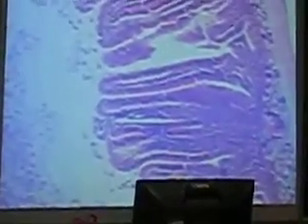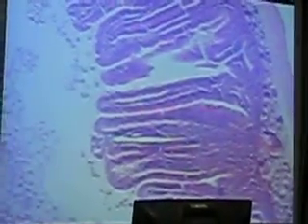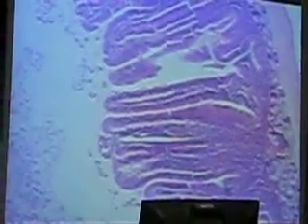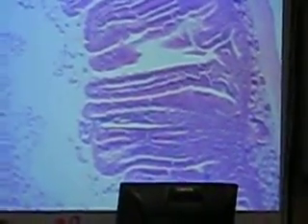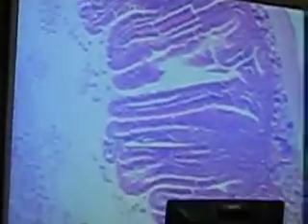One thing you'll notice is when you get into the intestine, you're going to notice these big, long, finger-like structures. Okay, and so here's a nice extended finger-like structure called a villus. Each villus contains epithelial tissue lining it, which is primarily what tissue? Simple columnar epithelial tissue.